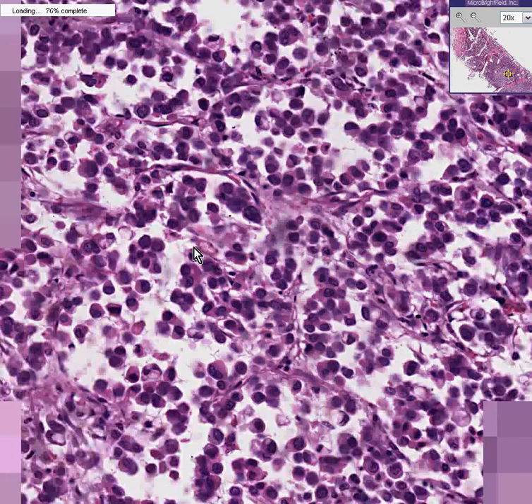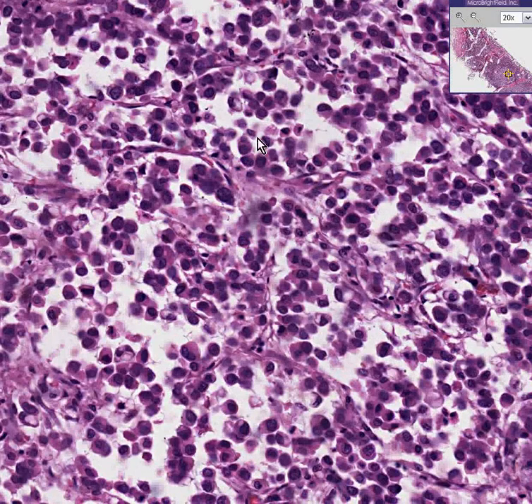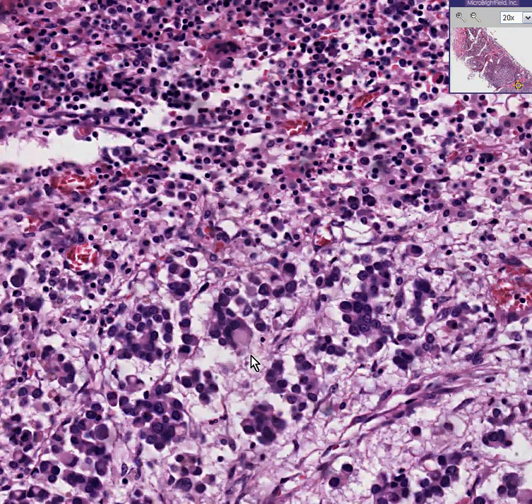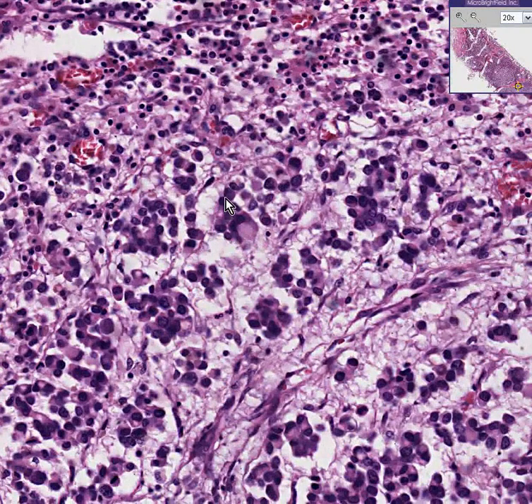And let's take another random area. In some of the areas, it looks like there may be vacuoles inside of some of these cells, like here, like here, like here. Let's go to another random area. Here's an area that looks like there may be some sort of vacuole. And in addition, you'll see structures like this, which if you have even not a good imagination, you could say, well, it looks like these cells are trying to form little glands.